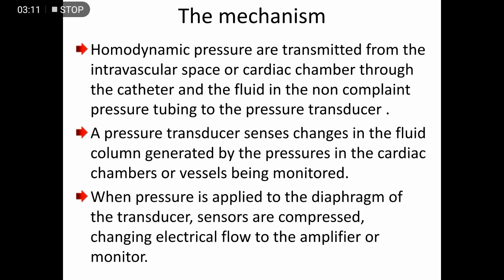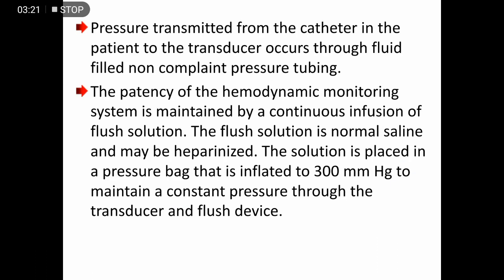When pressure is applied to the diaphragm of the transducer, sensors are compressed, changing electrical flow to the amplifier or monitor.